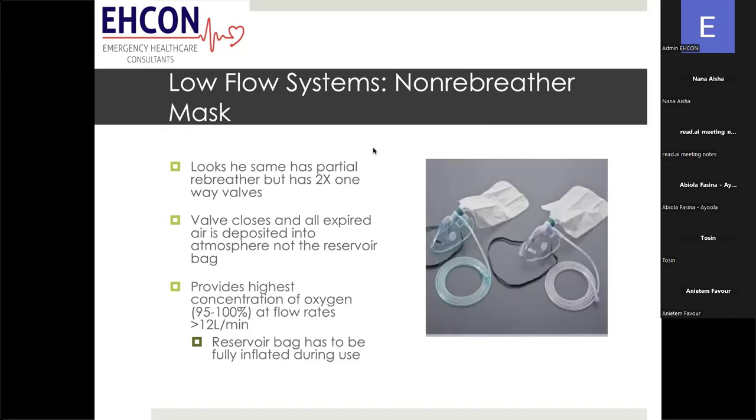The same downsides as the partial rebreather apply, meaning that it's uncomfortable and patients can't keep it on for long. You can't really use it if a person is vomiting; they have to be suctioned first. They do need to have some sort of mental status that is still there because they need to draw the oxygen into the reservoir bag. So again, this is not appropriate really in a code. It's not really appropriate for people who have major intracerebral damage, where they might have had some damage to the respiratory centers. You really need to consider another option.